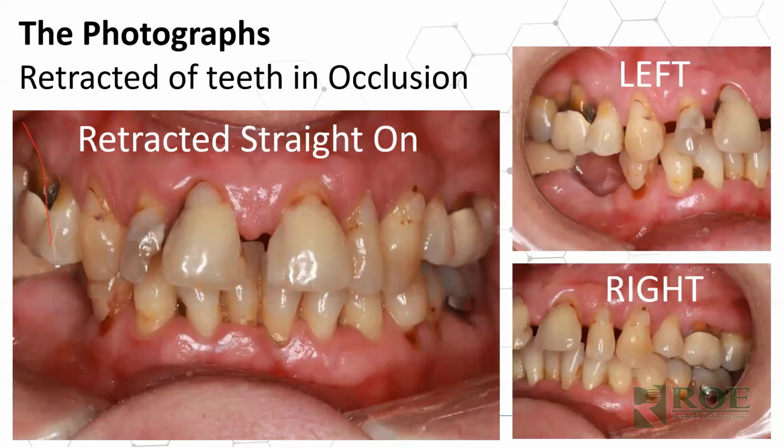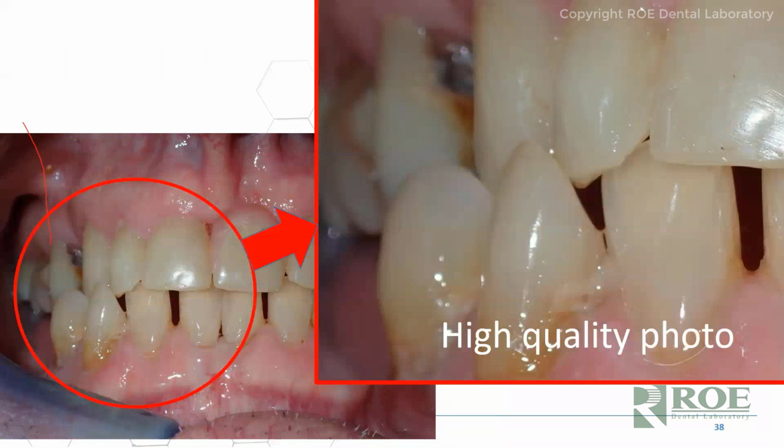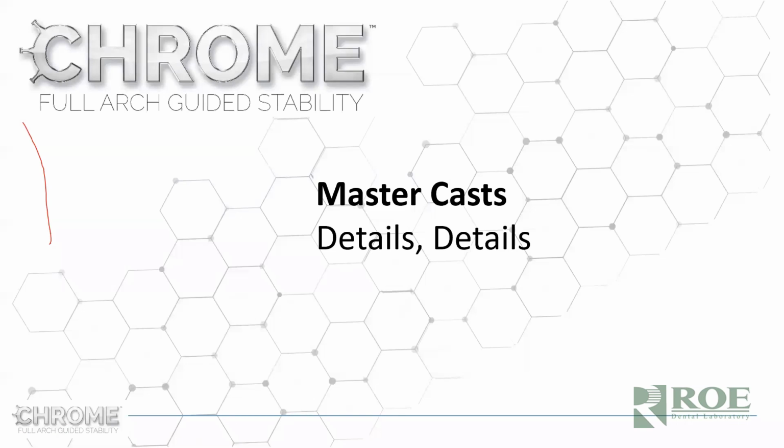And then the other series, as already mentioned, teeth in occlusion. We take these images and put them on a big screen here at our stations with your models in hand in the articulator, and we confirm that the case is articulated properly. Articulation and occlusion are just some of the most important things that we do here, so that you have a successful surgery and a good bite experience. Part of that is just these simple photographs sent in with a case. So we magnify them, and we literally look back and forth from the screen to the models and make sure that we're articulated right.